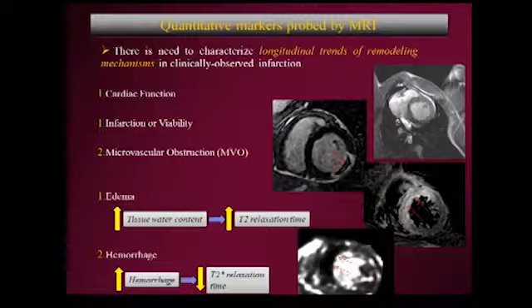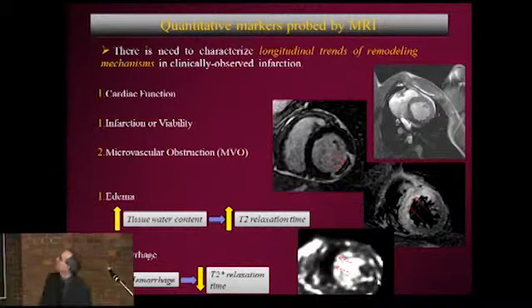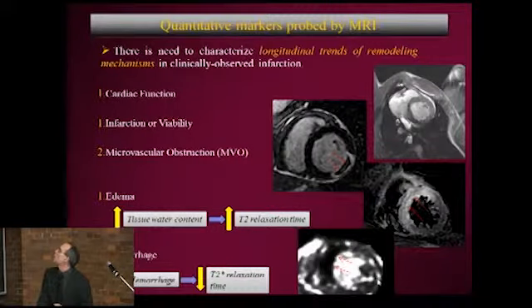Beyond that, there's another tissue contrast called T2, which is basically how fast the MR signal decays away, which can indicate water content. That's very important if we're trying to understand inflammatory responses, which is one of the responses associated with the ischemic insult. What that looks like in an MR image that is, quote, T2 weighted, is a bright area. That suggests that this area of tissue after the acute ischemic insult has become inflamed, has more fluid in it, and is edematous.